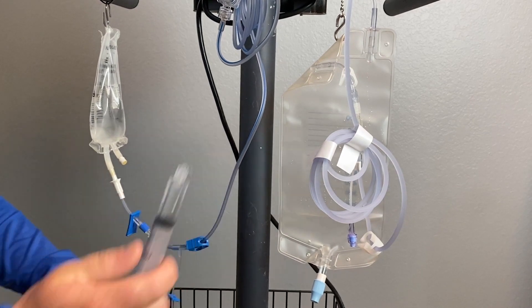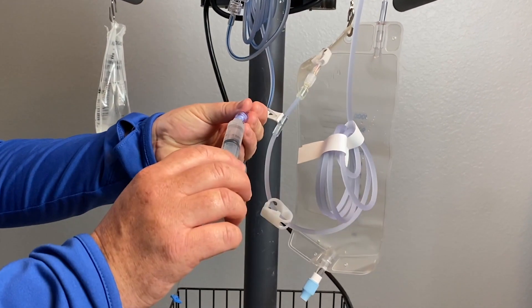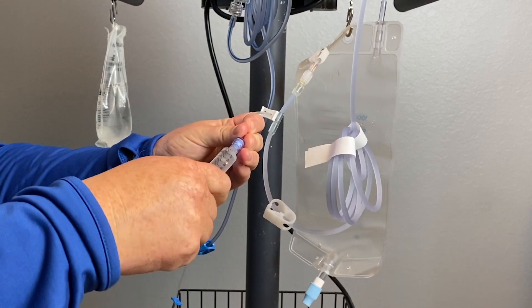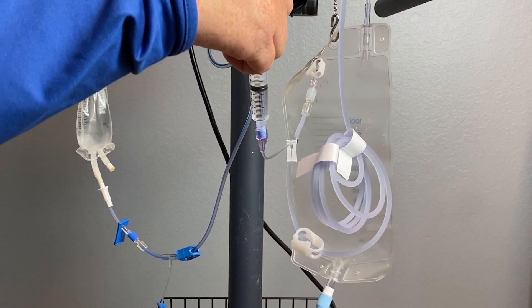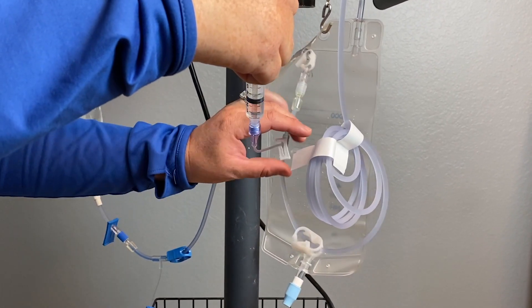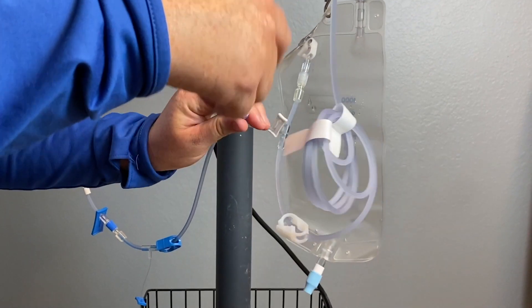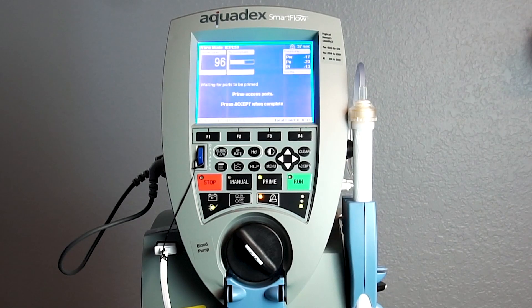Aspirate any air. Connect the syringe to the white or clear access port on the infusion side and infuse until you can see that the access port is fully saturated with saline. Clamp and disconnect. The access ports are now fully primed.